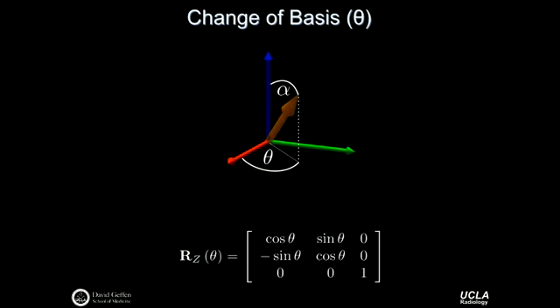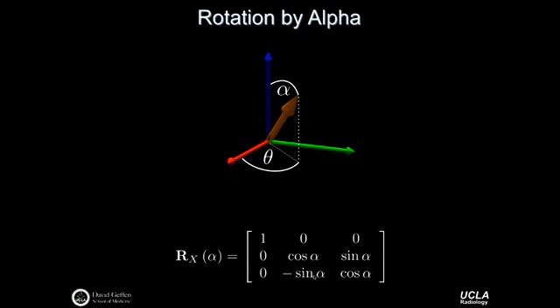The way we conceive of this is that to account for the underlying phase of the RF pulse, we just do what's called a change of basis. You'll see how this comes together in just a second. A change of basis just means we're going to rotate about the z-axis. You can see this transformation as being a rotation about the z-axis because it's just this unit vector in the far right-hand column. So we're going to rotate our perspective, our view, by theta, the phase that you've chosen for your RF pulse. We're then going to have the action of the RF pulse here as a rotation around the x-axis, so just another rotation in that new coordinate frame.